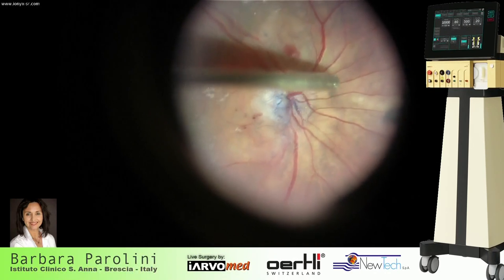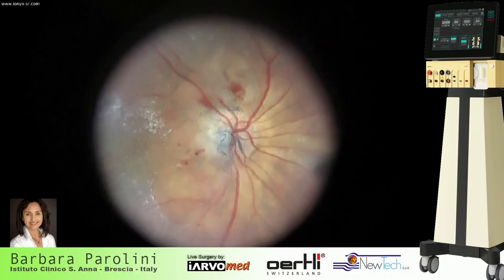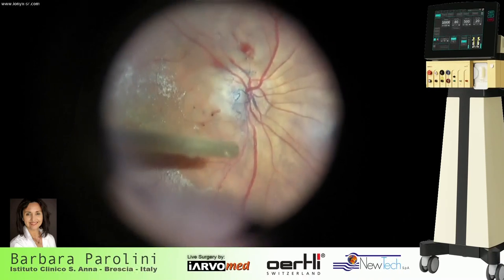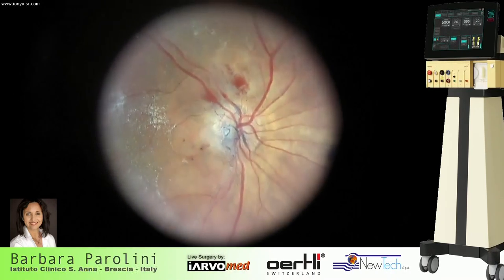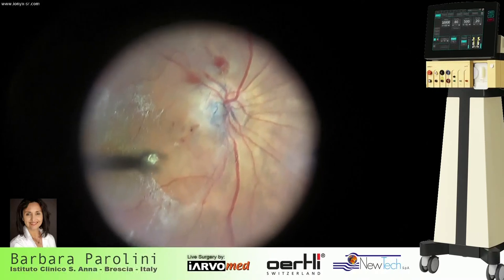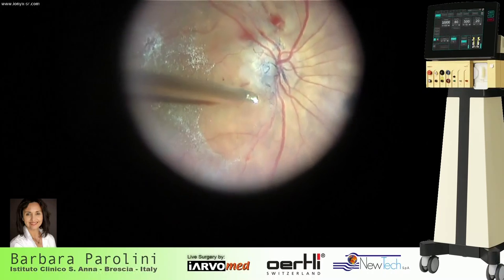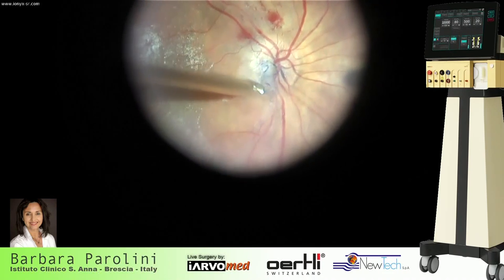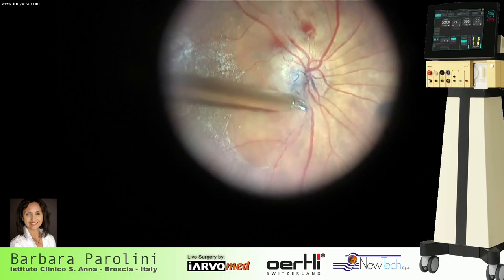Hello? Yes, I can hear you. Yes, Dr. Borse here. Can I speak to Barbara? Yes, it's Dr. Borse from India, right? Yes, welcome. So I am performing, as you can see, I think, I have peeled the ILM in this area, but when I reach the edge of the optic nerve, the peeling stops. And so I want to know how much to move on in peeling on the epipapillary zone.